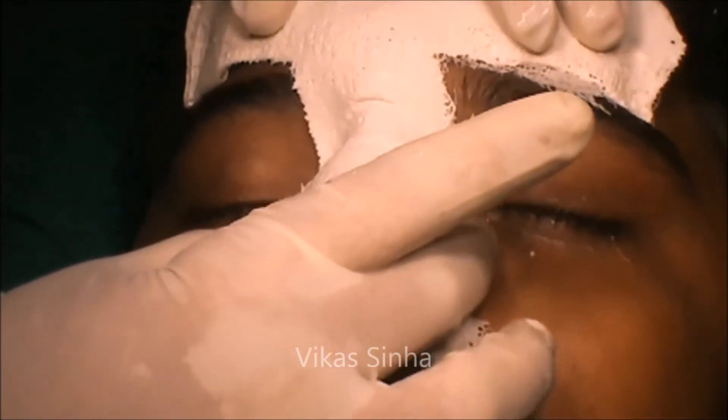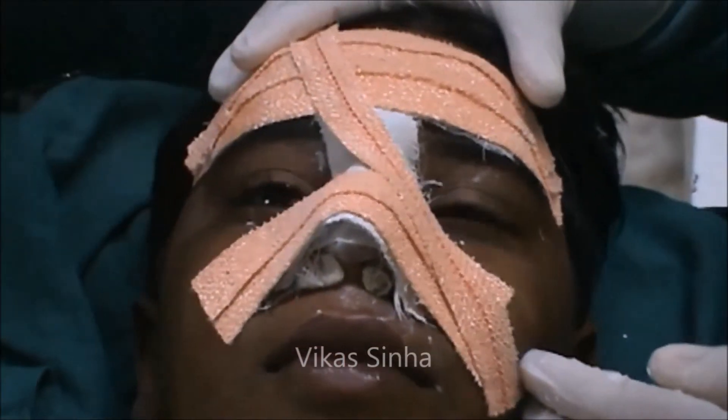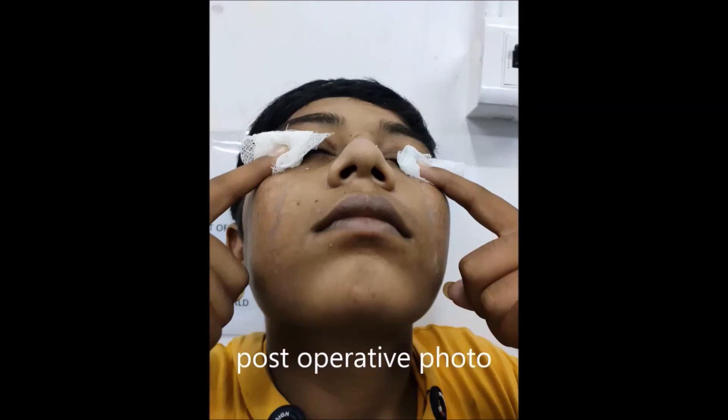And a POP cast is applied, which is to be removed after three weeks. Now I can see the post-operative picture. After three weeks, the nasal bone is perfectly aligned.